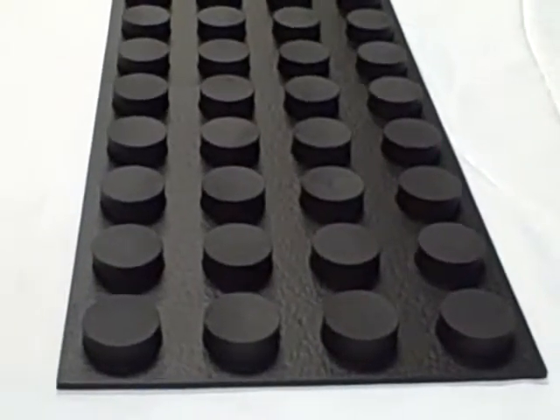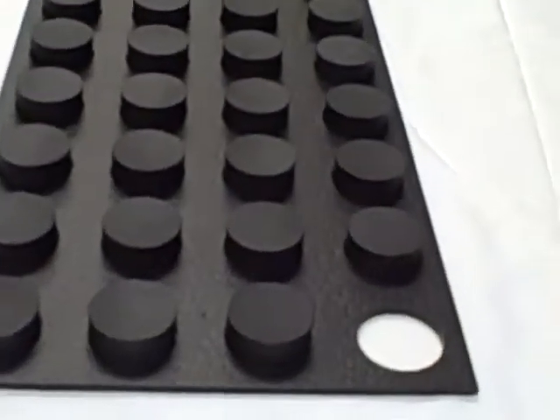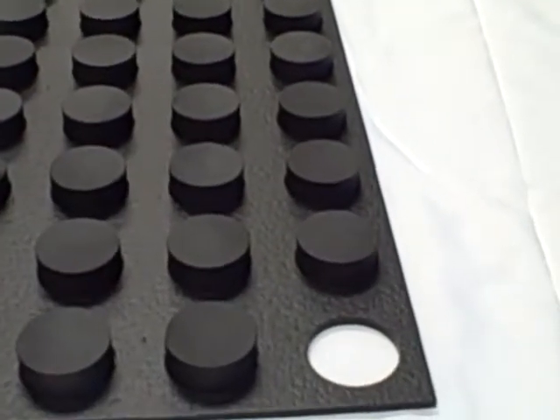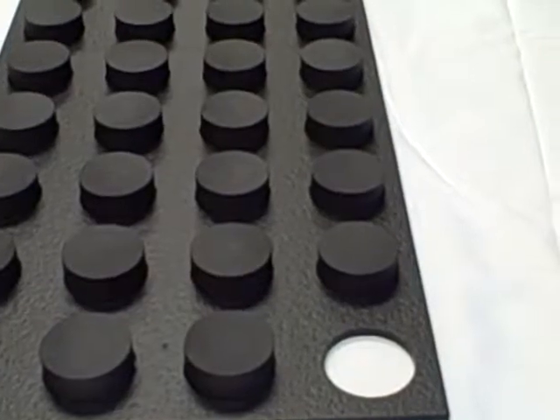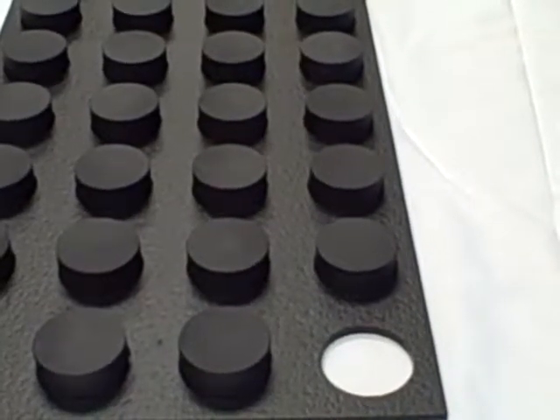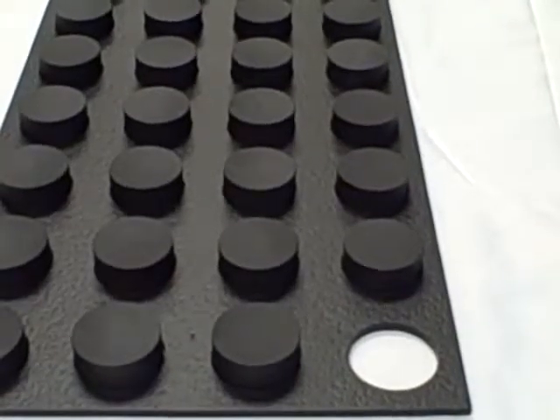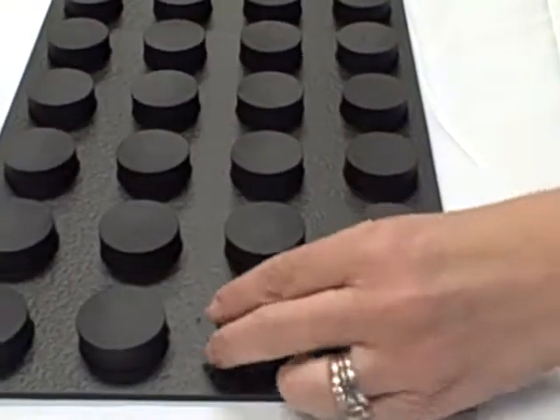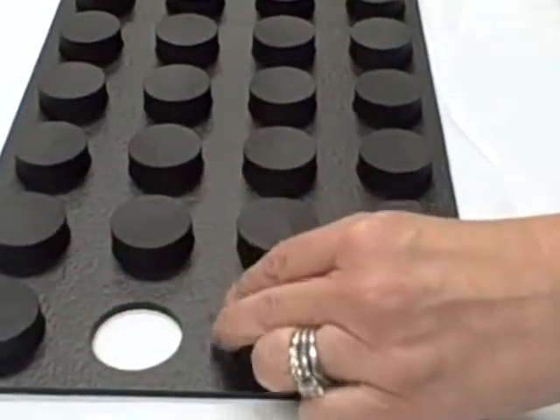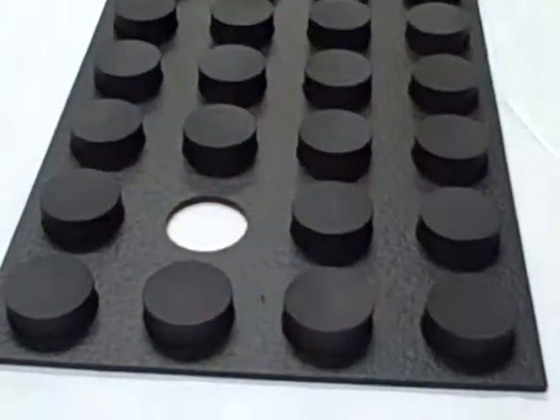Okay, the third test is called the displacing test. And for this one, you remove the block in the top right corner. So now what you're going to tell your client is the object of this test is to see how fast you can move the blocks one at a time from one hole to another. And again, you'll always do it with the unaffected hand first. So what they're doing is they will move the blocks like this. When they get to the bottom, they'll move this one over and so on.